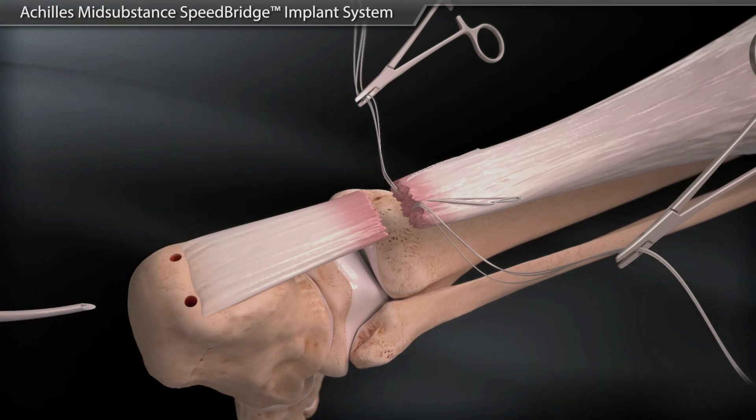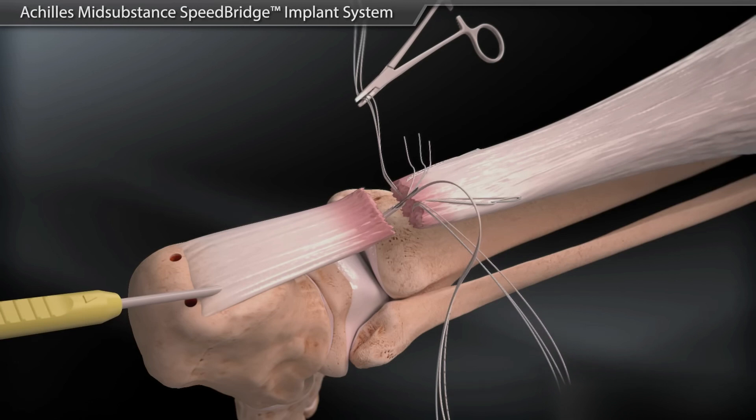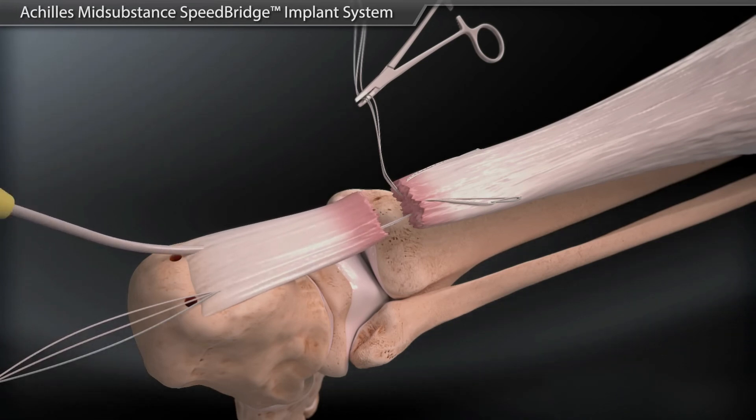A lasso is passed through the distal stump of the Achilles out of the rupture site. The sutures from the proximal stump are then passed through the distal stump and out the stab incision distally.